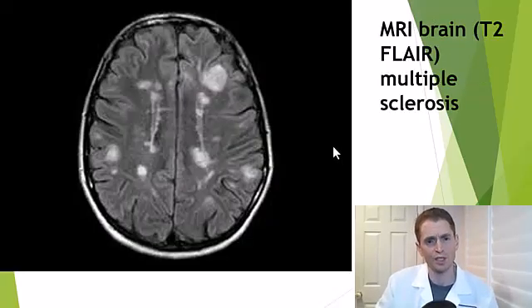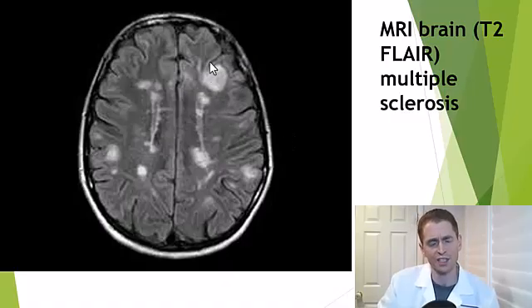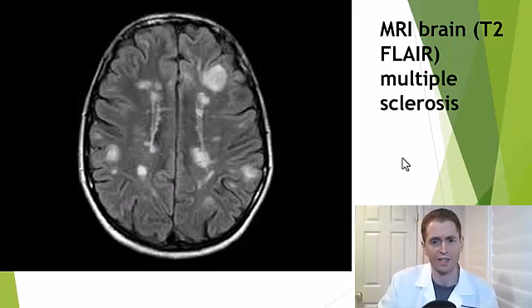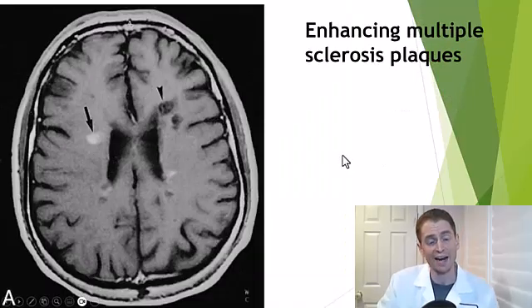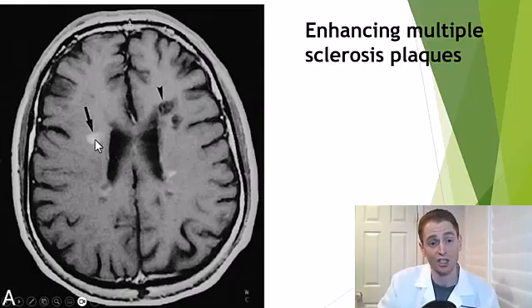This FLAIR image shows multiple sclerosis, an inflammatory disease of the central nervous system with well-demarcated lesions in the subcortical white matter, the periventricular white matter, and juxtacortical areas. In this next image, gadolinium-based contrast dye is given, which can cross the injured blood-brain barrier and get into the active plaques, showing active inflammation.